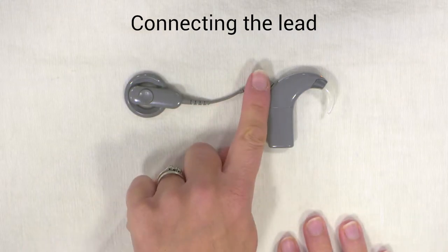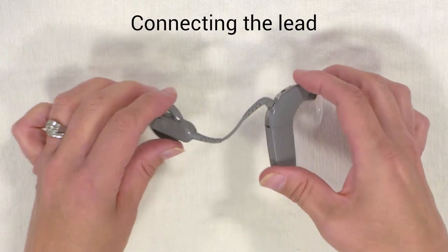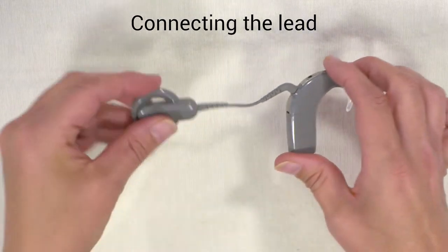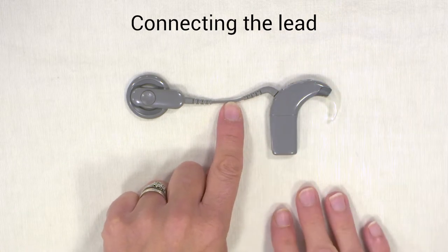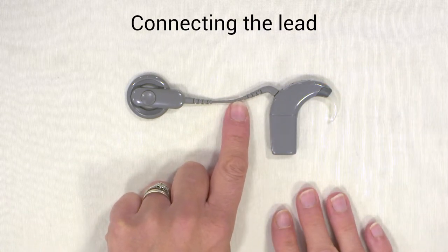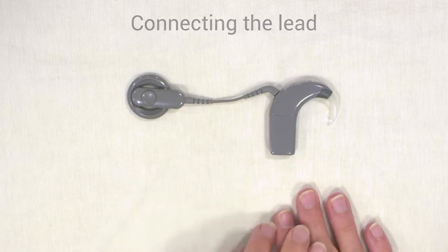The lead can be the weak point of the processor because of general wear and tear when you're putting it on and off your head. This can become worn and broken, so it's one of the first things you check if your processor is not working properly.